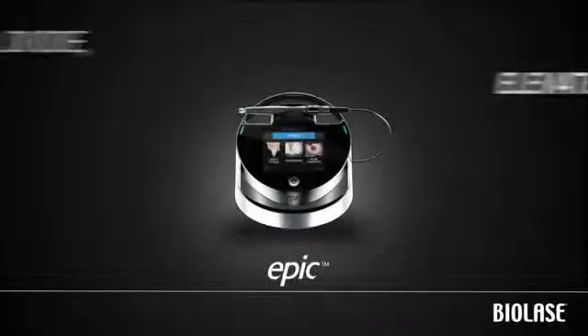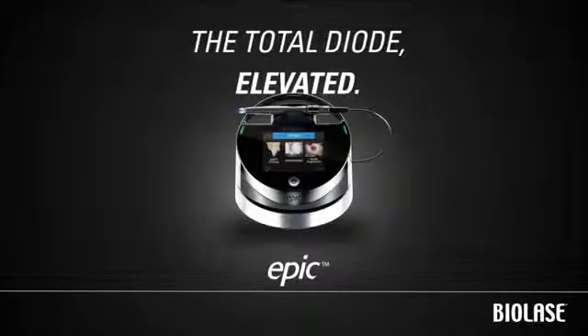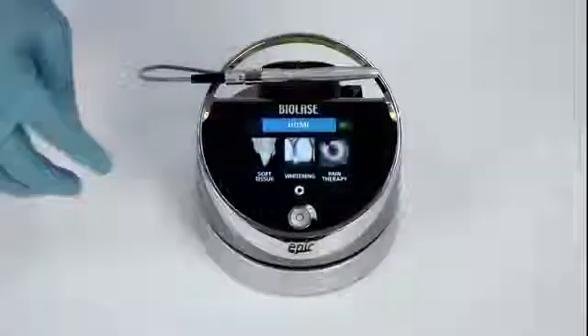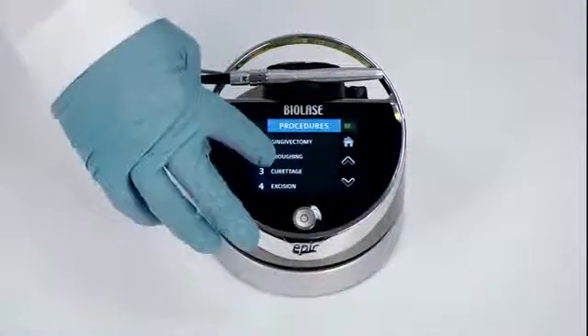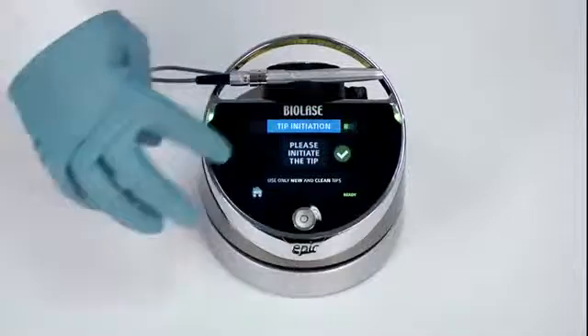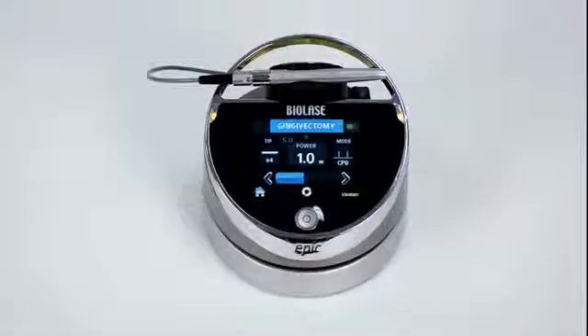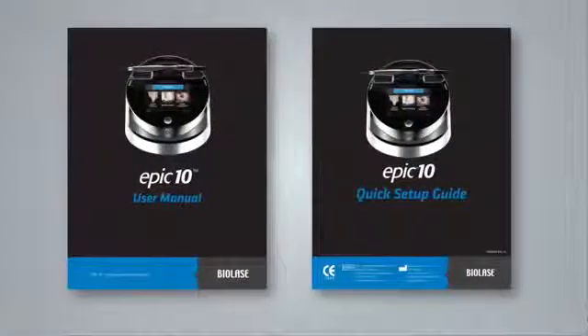Congratulations on purchasing the EPIC 10 Diode Laser System from Biolase. EPIC is the world's first diode laser system that combines soft tissue surgery, whitening, and pain therapy in a single device, with an easy-to-use touch screen that simplifies the steps needed to get to work, regardless of which treatment type you are using. For complete details, please refer to the EPIC user manual and quick setup guide included in your packaging.